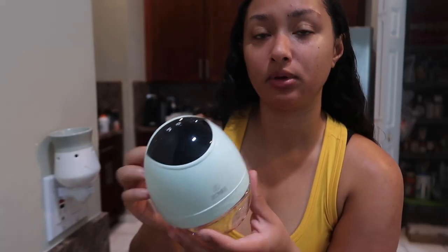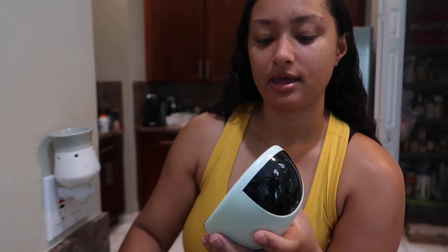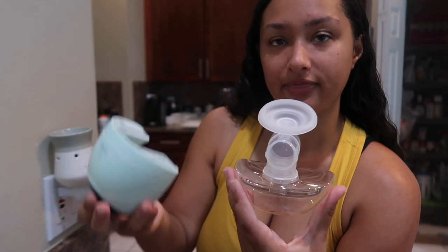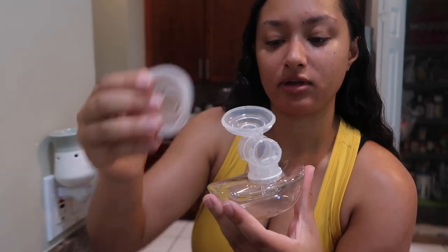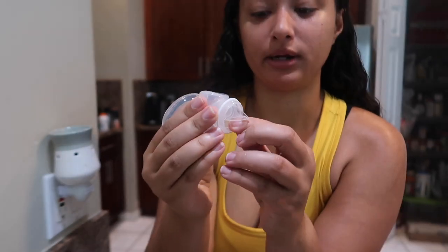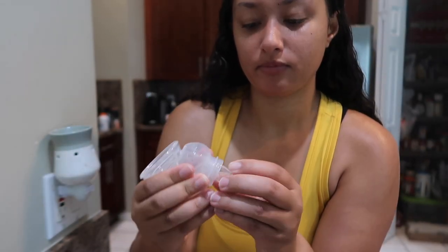I'm gonna go ahead and disassemble it so we can clean it. First, you're just gonna take off the breast shield on the back, and then you're gonna just slide off the motor. You just push back, it comes off like that. And I'm just gonna take everything apart so we can clean it. This just twists off. And then we're gonna take off the band and take off the valve. So now I can go ahead and clean it.